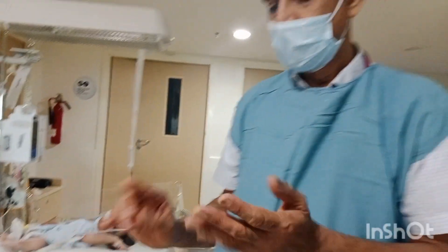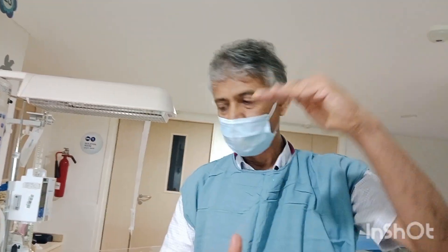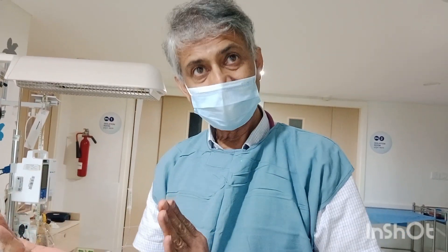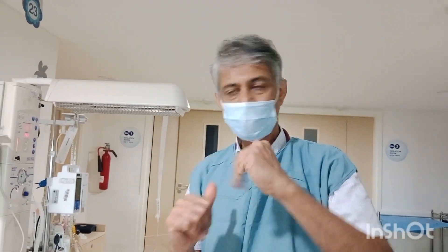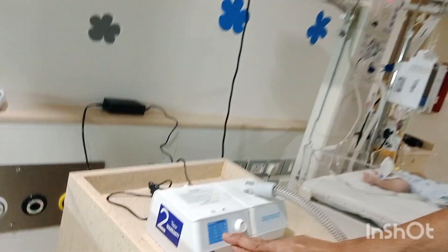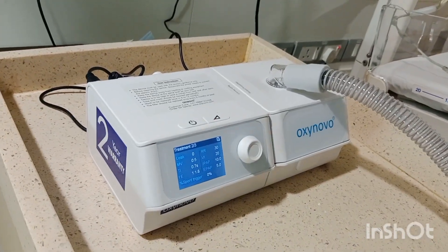The parameters to adjust are: two pressure levels — IPAP can range from 2 to 30 cmH₂O and EPAP from 2 to 25 cmH₂O; normally we keep around 10 and 5, with a difference of about 5. The backup rate is 30 and the inspiratory time is around 0.7 seconds.